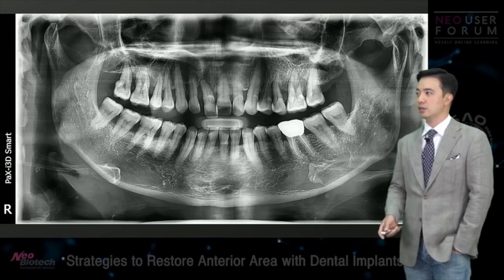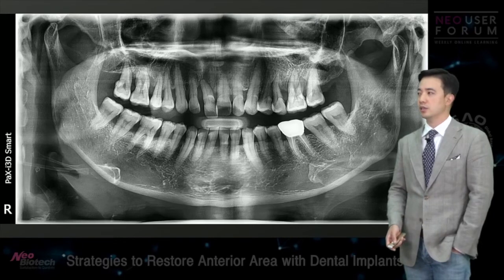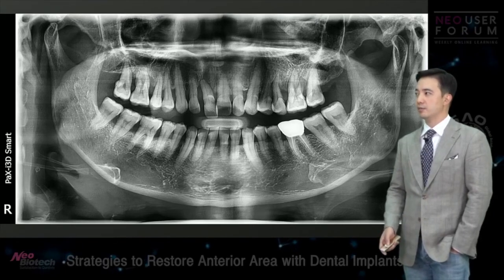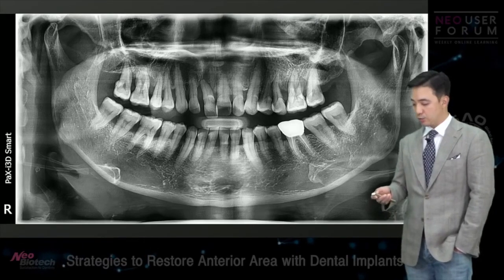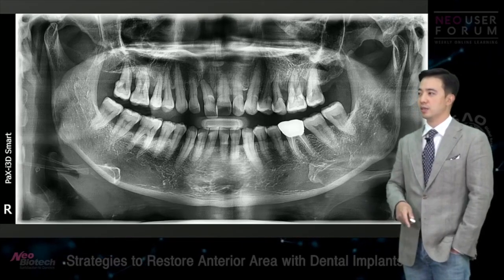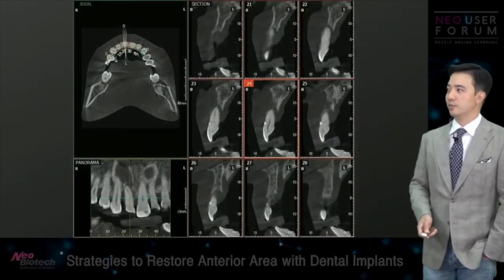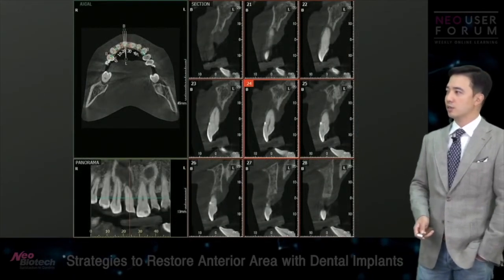up having a really, really long clinical crown with recession. So it's going to look bad for sure. So I just didn't want that. And after having those kinds of experiences with massive GBRs and all that, I just wanted to avoid those kinds of situations. But look at this.